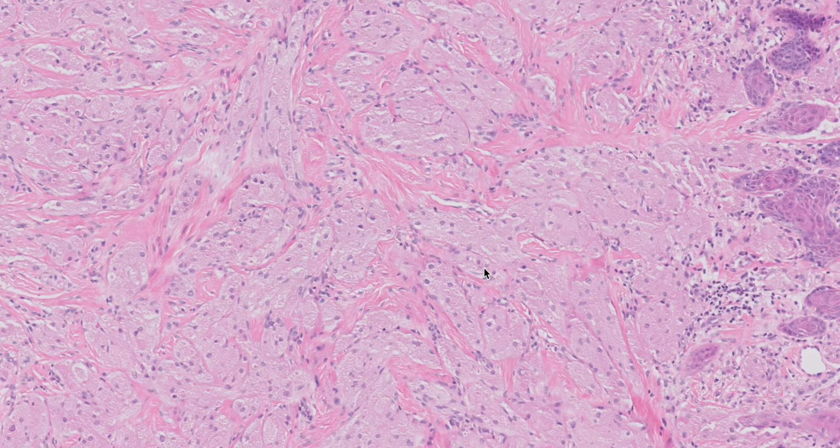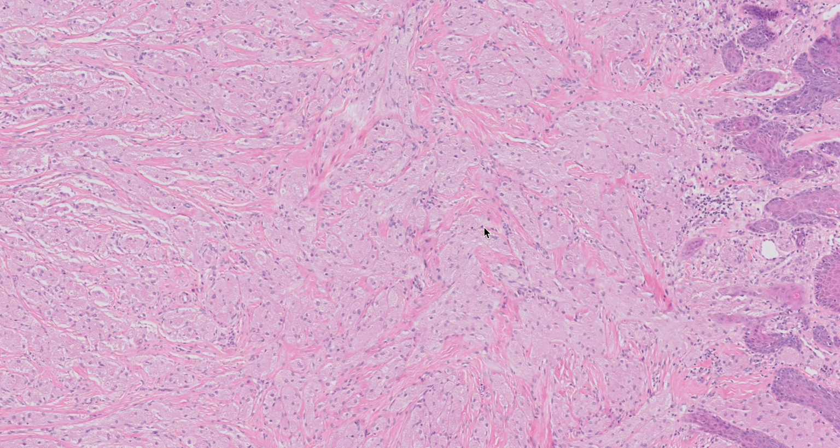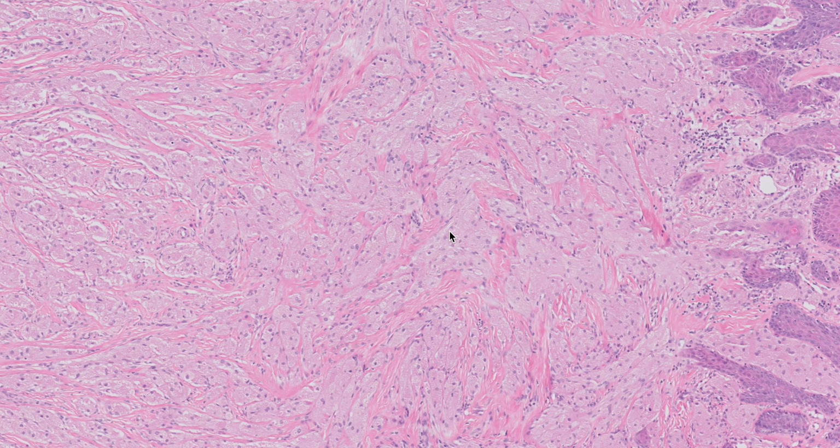Now let's go back to the lower power. Now I can easily appreciate the cell morphology here once I've understood how the cell looks in a higher power, right? Definitely, whatever I said initially, it's splaying the dermal collagen here, with a little bit of a more intricate collagen network here, and all of them are a syncytial arrangement of the same epithelioid cells that we described, right? Now what could be the differential diagnosis? I'm having a good amount of clusters of cells which is not having a very defined tumor-like morphology. It's infiltrating everywhere. It's an irregular thing, right?